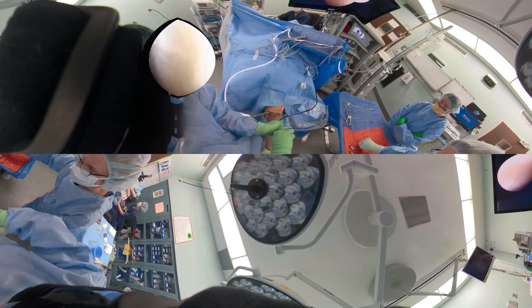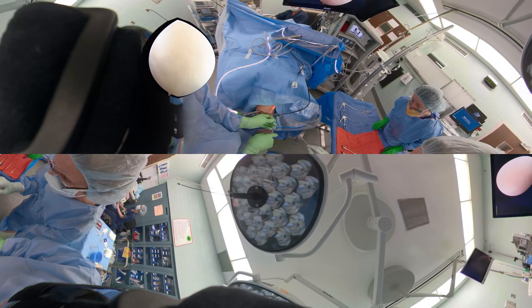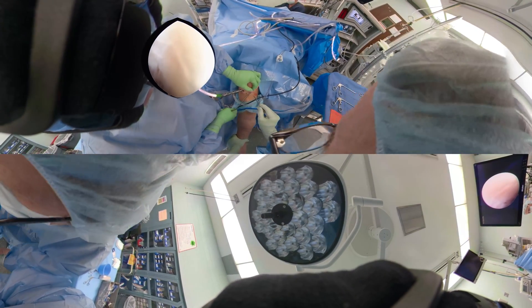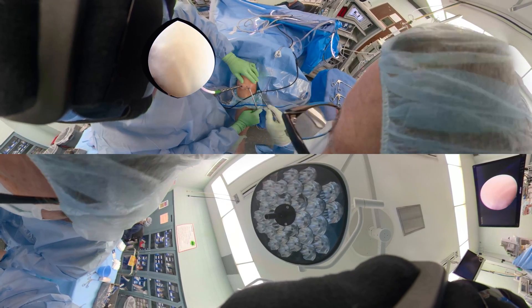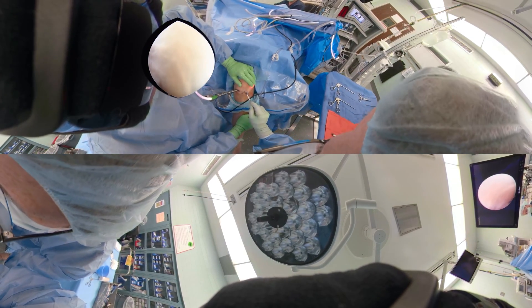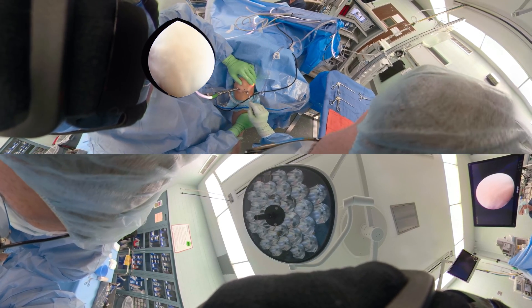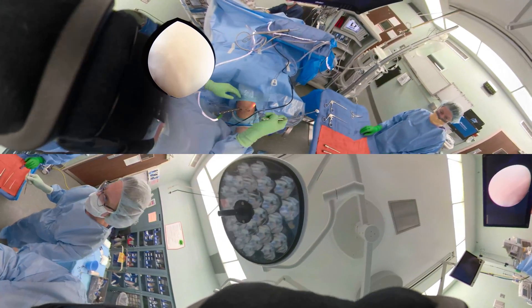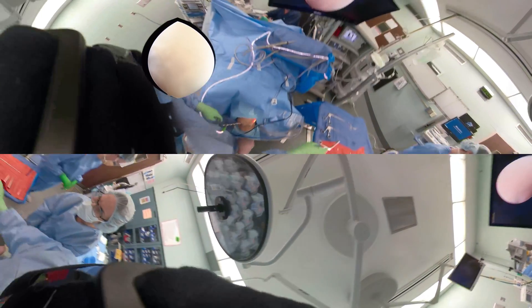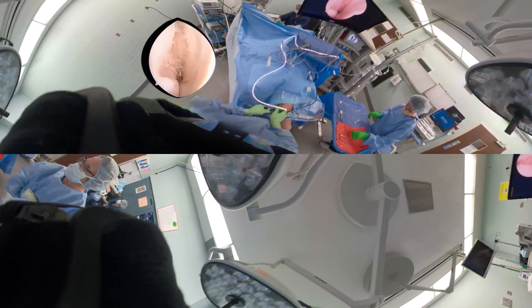Have somebody hold your scope, and see how he's grasping that Schlesinger very tight — you can see the light is in the lateral gutter. Making a little increase in the incision so we can get the loose body out. He's pulling, making a little bigger mini arthrotomy, keeps on pulling, and out comes the loose body. Didn't lose it in the soft tissue — loose body removed.